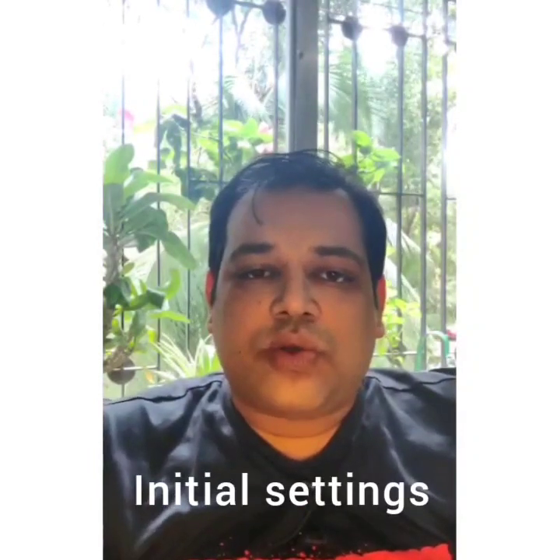So that's how the different modes work, and I hope you have understood and it is clear to you how these modes work. Now what are the initial settings for you to keep? Whenever you intubate a patient, I think we will discuss the process of intubation in a separate video. But suppose you have intubated the patient and confirmed the position of the ET tube, then you come to the ventilatory settings. So you start with 100% oxygen level, FiO2 100.